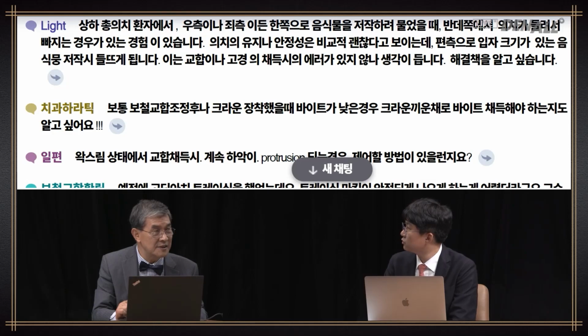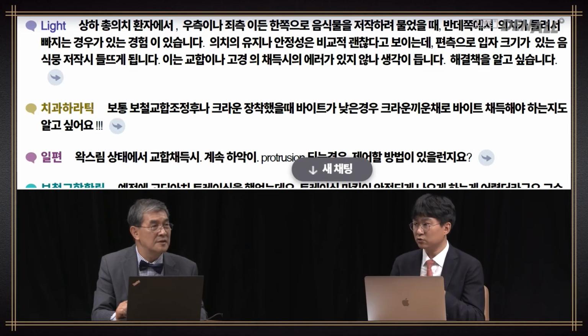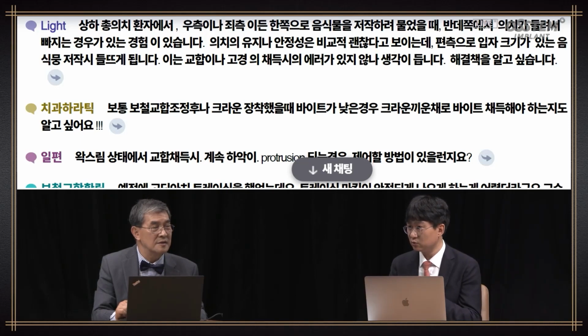This is about balanced occlusion. There are various factors involved in keeping one side of the denture from lifting up. A denture base should be wide enough, or a denture with properly positioned artificial teeth can collapse. So to a certain degree, the denture base should be expanded. Also, when artificial teeth are positioned too outwardly, the opposite side can be lifted up when chewing. Also, when the alveolar ridge is severely resorbed, this happens more in the maxilla than the mandible.